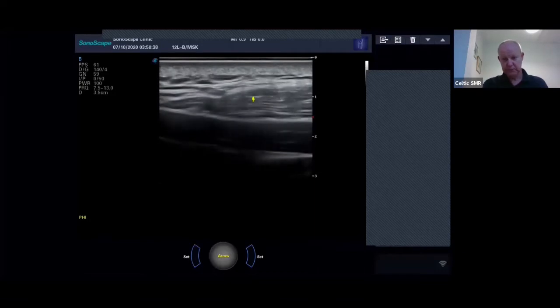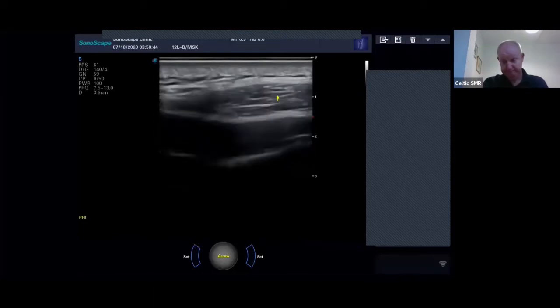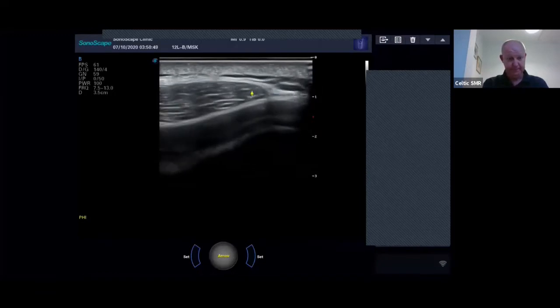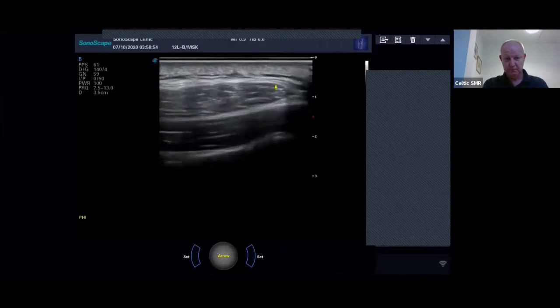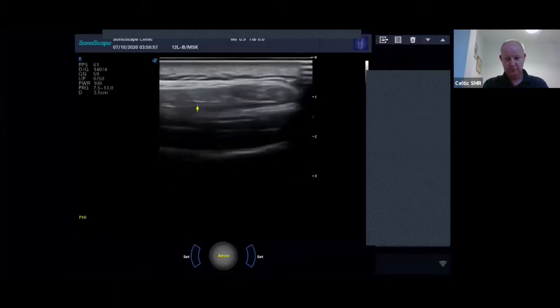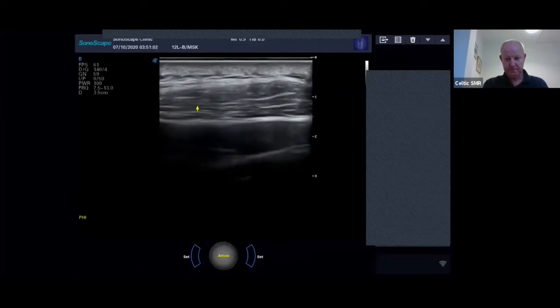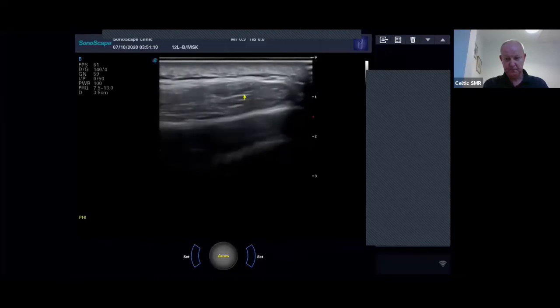You can see that the contents here are very similar in striations to the subcutaneous fat here. It's not a lot different. You can sort of make out maybe slightly hyperechoic to it. So you mentioned that slightly hyperechoic to the subcutaneous fat. And then the other thing is Doppler. Put the Doppler on if there's any flow. Obviously, optimize your Doppler settings to low flow. And just check if there's any Doppler signal in that. And if there's any breaching across layers, cross fascial planes like this.